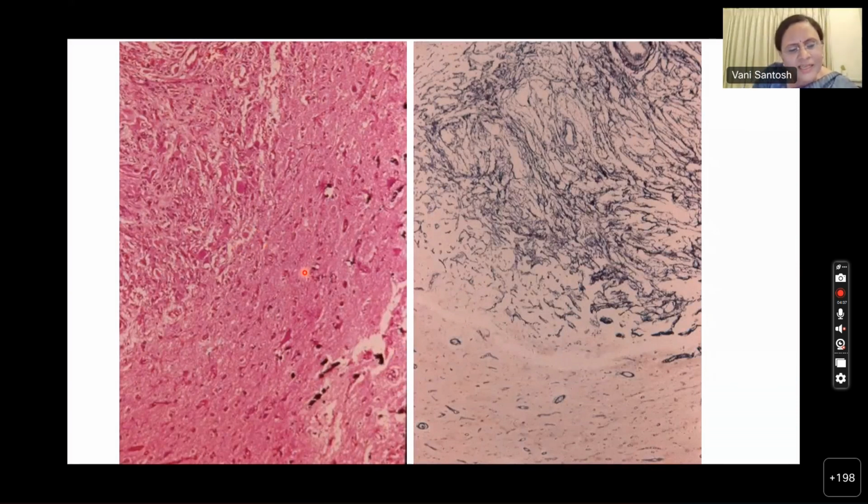You remember Dr. Kajari said that she felt it was more a circumscribed tumor than a diffuse tumor. Here what you can see is a nice pushing margin. This is the tumor and this is the brain parenchyma. There is some calcification. There is a pushing margin over here. In the brain, no brain tumor is encapsulated within the parenchyma. When we say a circumscribed tumor, what we mean is that histologically it will have some sort of a pushing margin. And the tumor was very firm because you can see that this is a reticulin stain.